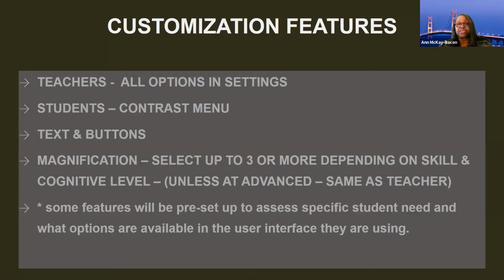Teachers, we just go over all the settings so that they can kind of get a feel of what they might set up for their students. And so we also go over the banner buttons, and we still go over any gestures that are included for that particular user interface that we're going to be using. So contrast, color, the modes, the reading modes, the gestures, all of that I go over with teachers.